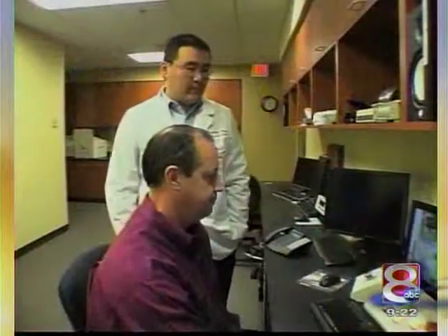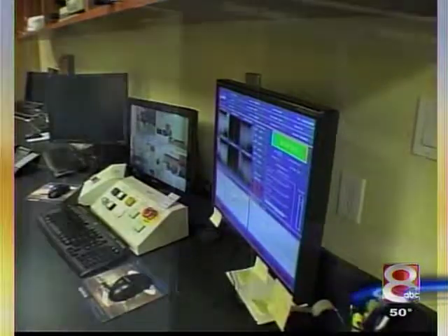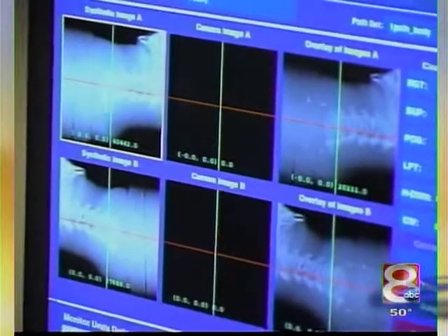But. Okay, do doctors recommend that a patient come in and try CyberKnife, or how does that work? Ideally, a patient would have a tumor that's very well defined. You can see the edges of the target that you're aiming for. But one of the things that's nice about the CyberKnife is that it's actually able to track in real time the movement of the tumor with breathing and respiration. So we can use Synchrony, which is a special system with the CyberKnife, or fiducial marker placement, so that the image guidance component of our CyberKnife and the controls, which are robotic, can follow that tumor as the patient is actually lying on the table and breathing.